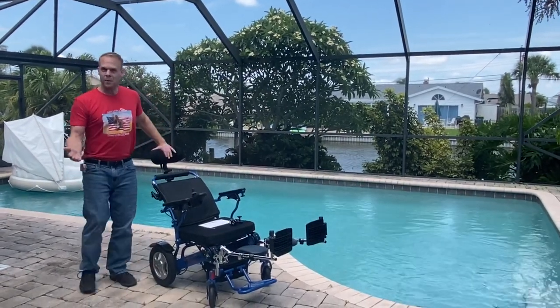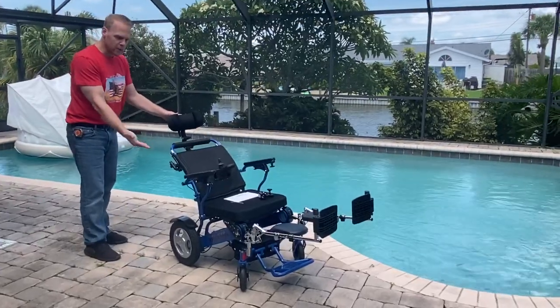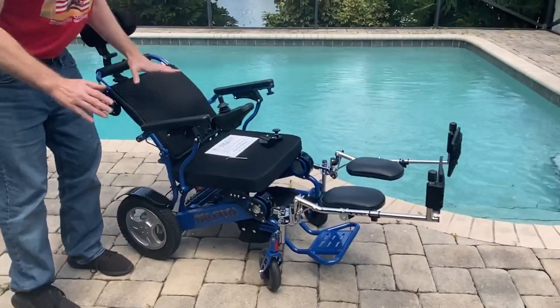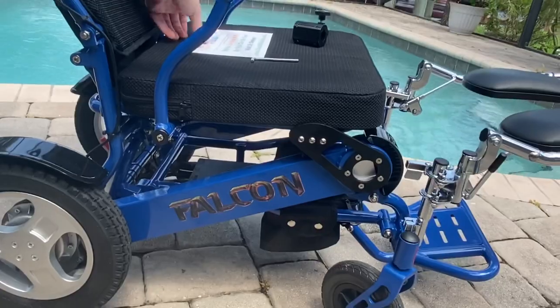Hello, this is Paul from Quicken Mobile, and as you can see, I am here with a Falcon reclining power lightweight folding wheelchair. The Falcon weighs 55 pounds with no batteries and 63 pounds with both batteries.